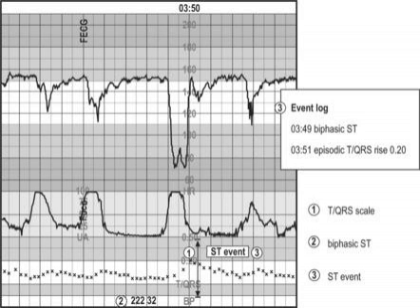In fact, electrodes were added to the probes to measure the electrical impedance of the tissue that it was in contact with, in order to ensure that it's in the right place. This works because the fetal cheek has a different impedance than either maternal tissue or the fetal scalp. Early studies demonstrated that this was feasible and came up with standardized tables used for calculating the fetal oxygen saturation. This early work found that the normal oxygen saturation for a fetus is between 35% and 65%, and that acidosis does not occur until the oxygen saturation falls below 30% and stays there for at least 10 to 15 minutes.